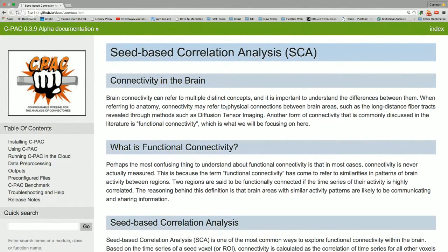And of course, the outputs that you have from the data are available at multiple stages of the processing, right? So if you don't want the Fisher transform, you can just find the data without it. If you don't want smooth data, you just go to the step before it. Or if you want to calculate the effect of smoothing, you go to the data before it, right? And so we do a pretty good job of trying to make as much of that available as possible.